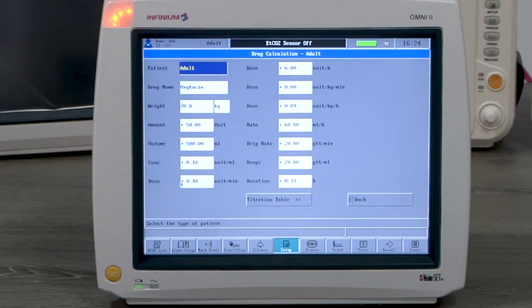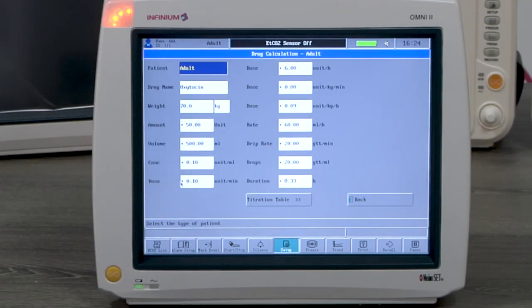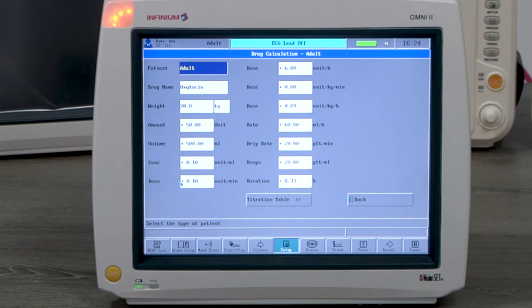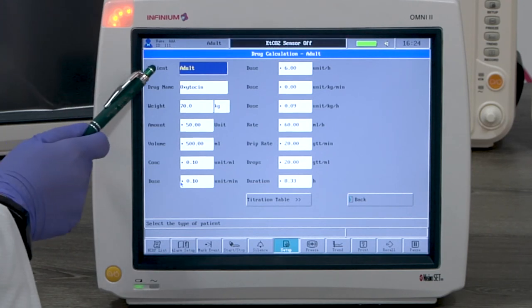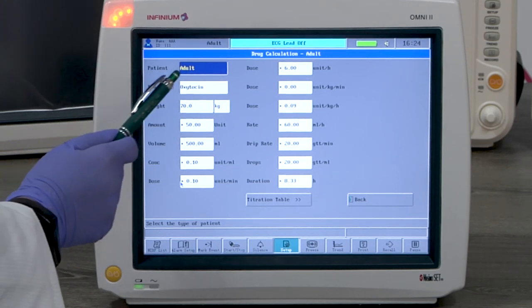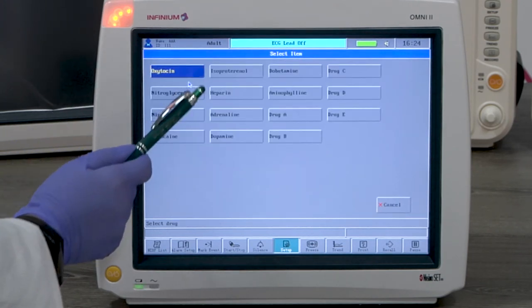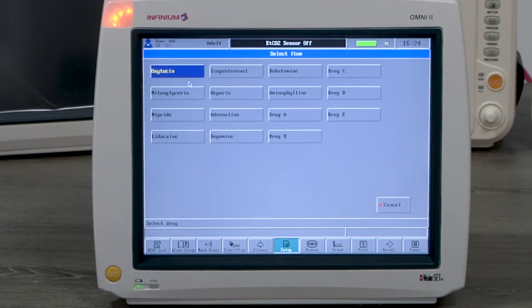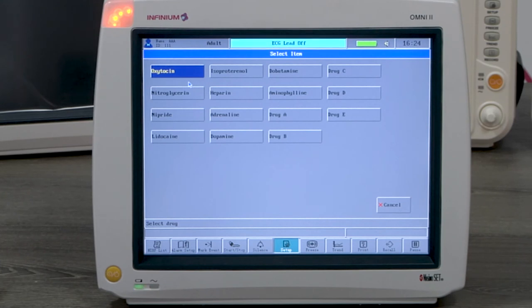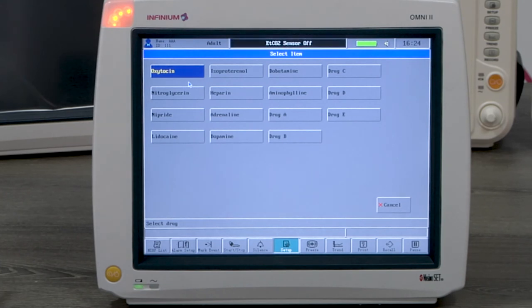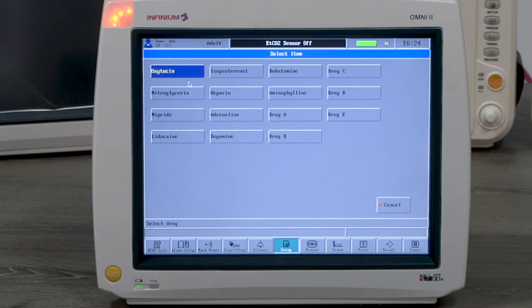Drug calculation is a calculation feature. It'll calculate the dosage based on the information you put in. You'll start with selecting the patient type and the drug name. If the drug needed is not listed, you can select drug A.